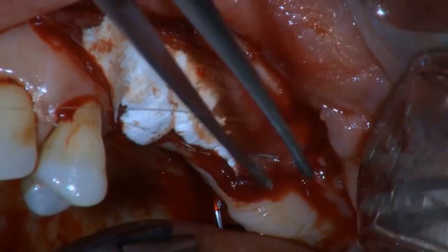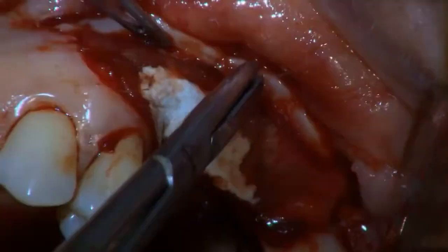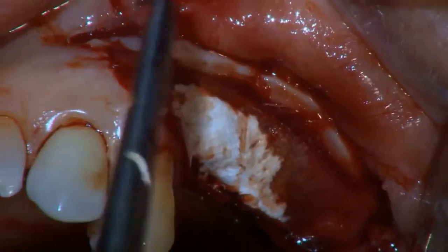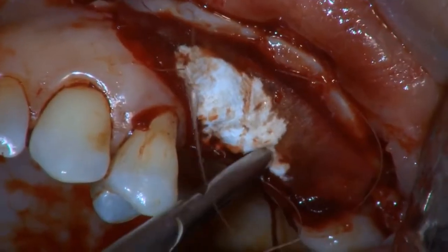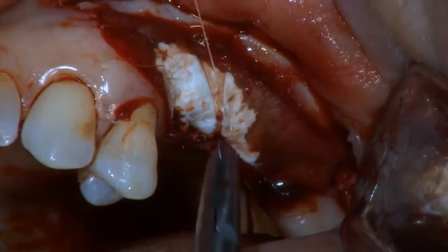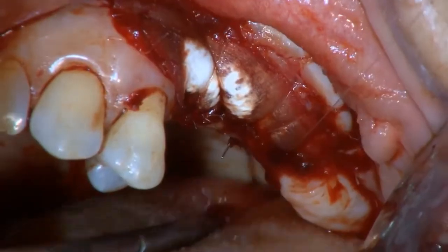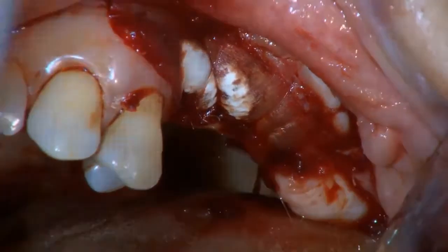The matrix readily adapts to the bed and is held in place with cross-mattress sutures. Here we are using 6.0 PDS-2 resorbable sutures. Another cross-mattress is added, so 3 cross-mattresses are holding this matrix in place.